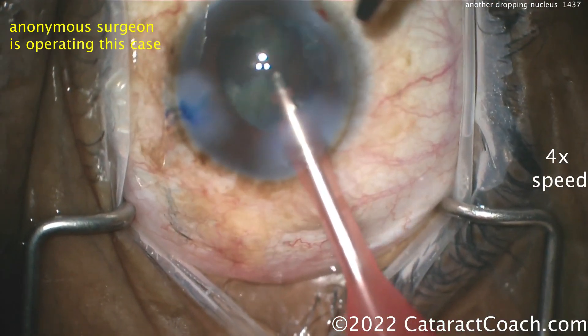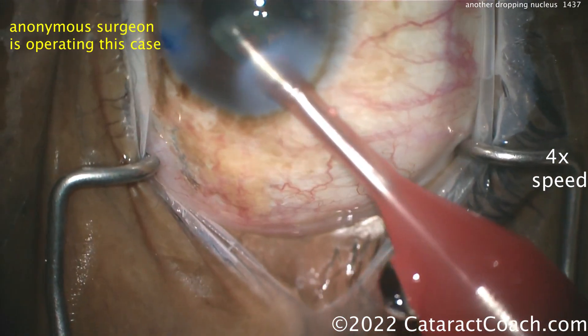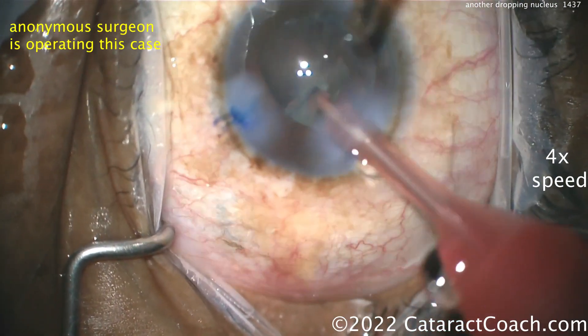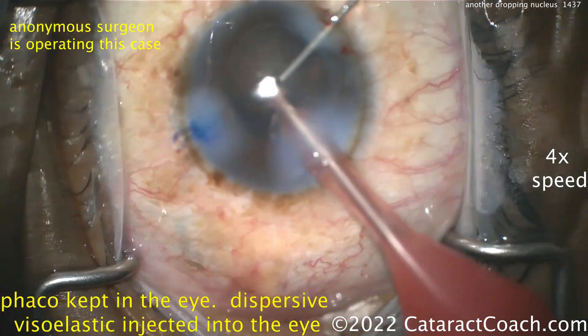At this point, listen to your machine. If your phaco machine goes ding-ding-ding while you're doing the phaco part, you may have vitreous already clogging the tip of your phaco sleeve or phaco needle. Be cautious. In a case like this, when it's already falling — just let it go. Trust me.